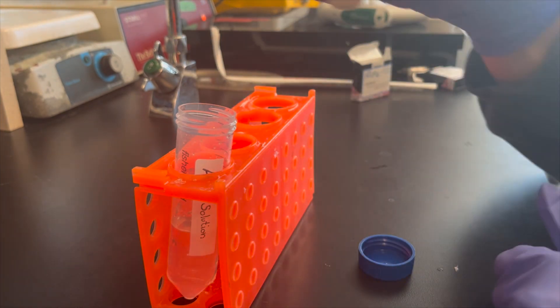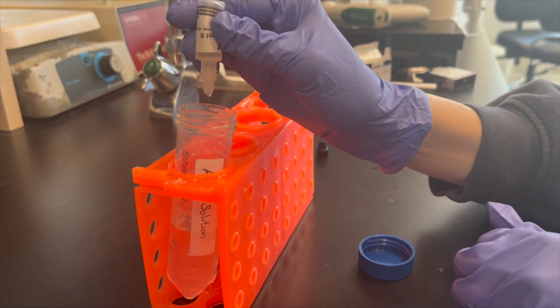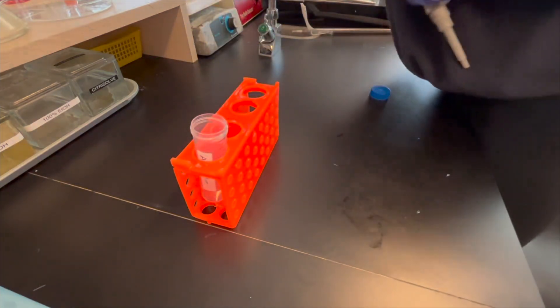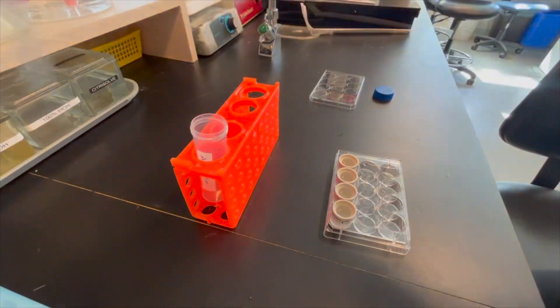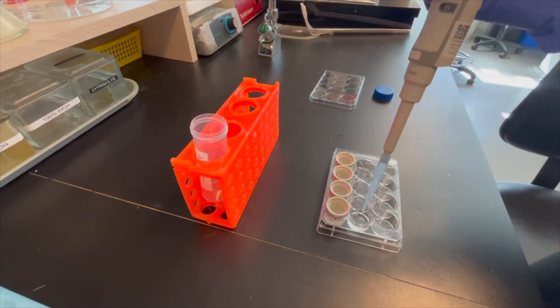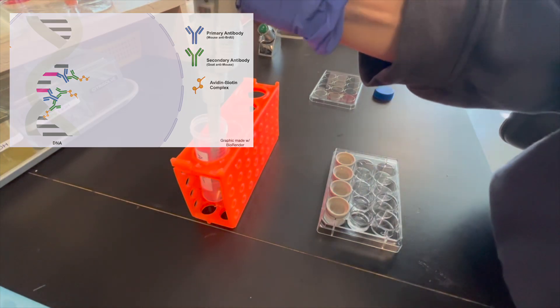We are using the Vectostain Elite ABC Toolkit. To make this solution, add 2 drops of reagent A and 2 drops of reagent B for every 5 mL of blocking buffer solution. Let this sit for 30 minutes prior to use. Pipette approximately 2 mL of the ABC solution into each well and transfer the tissue over. Leave shaking for 1 hour at room temperature. The purpose of this step is to add enzyme complexes to secondary antibodies.